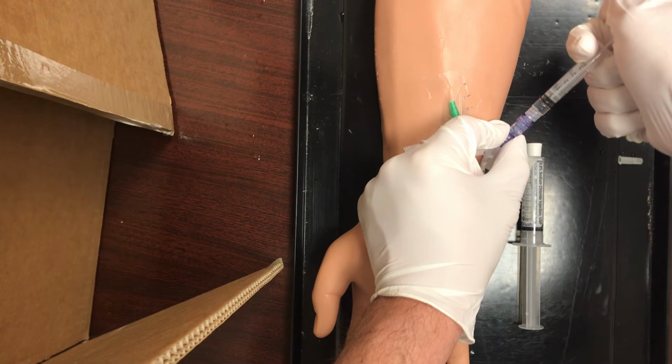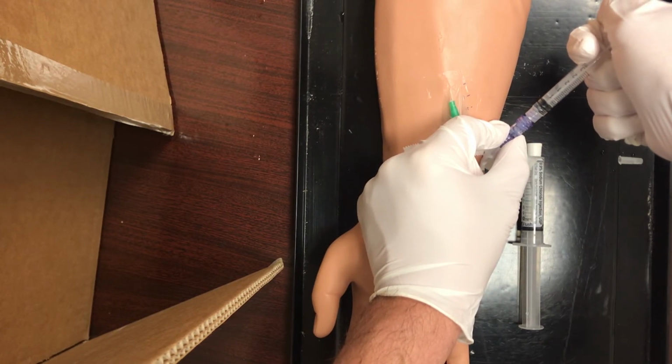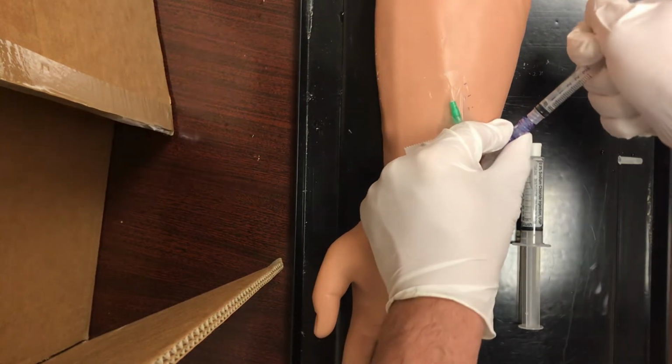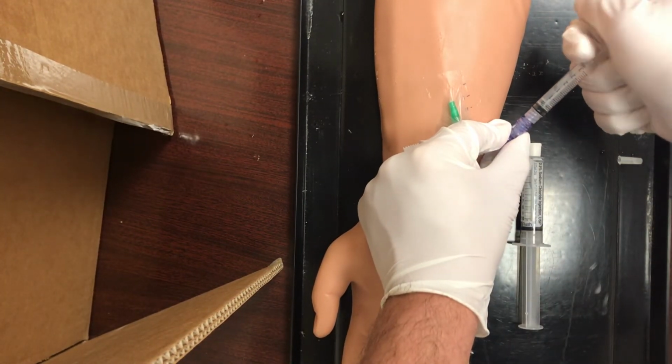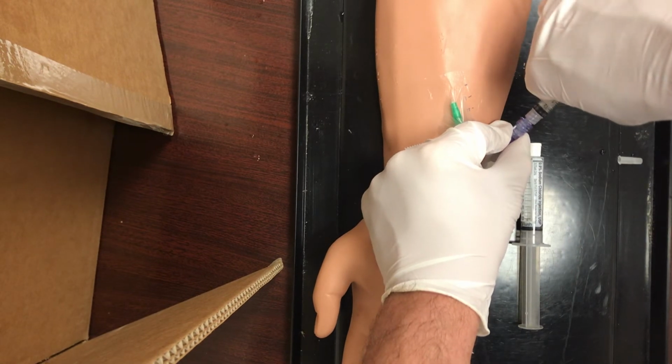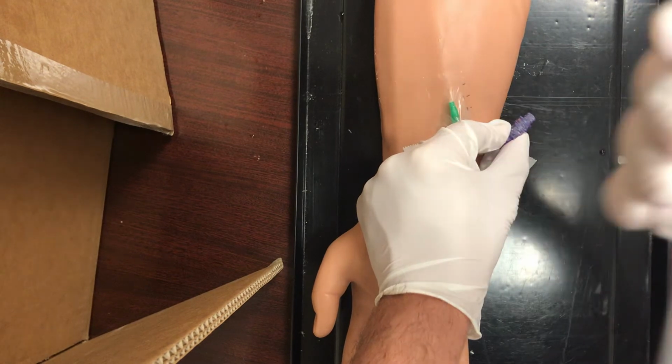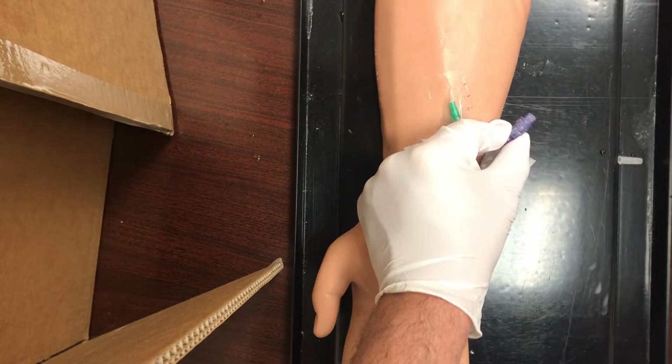Okay. I timed that to be done at 8 minutes and 5 seconds, right on the dot. Okay. Now, removing that. Next thing we're going to do is take our 10 ml flush.